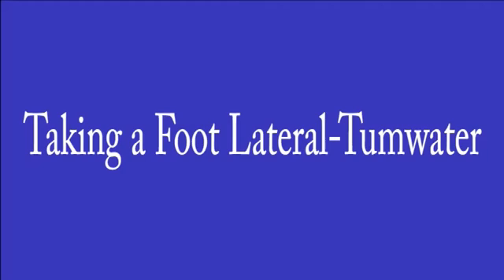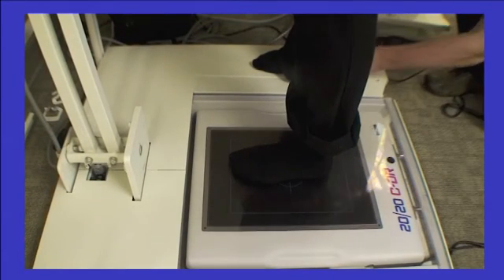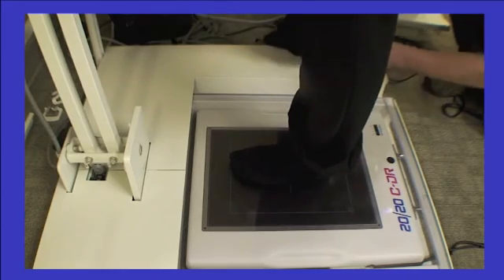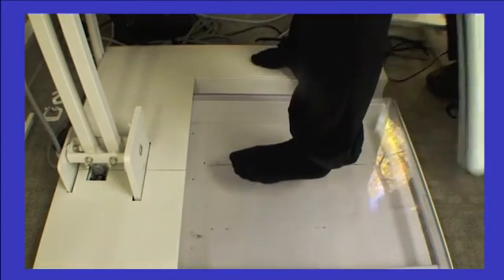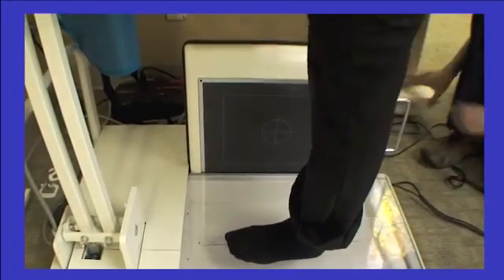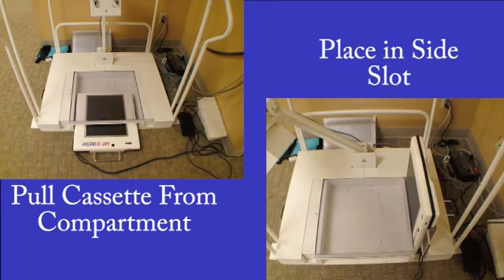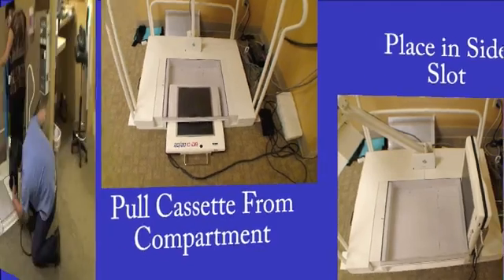To take a lateral foot and all ankle views, you will need to adjust the cassette. For calibration reasons, you will need to open the slide out on the right side only. Do not use the left side slider. When the right side slot is open, you will carefully pull the cassette by the handle out of the middle area and place it in sideways in the slot so that the black exposure side of the cassette is facing the patient and the handle is facing you.